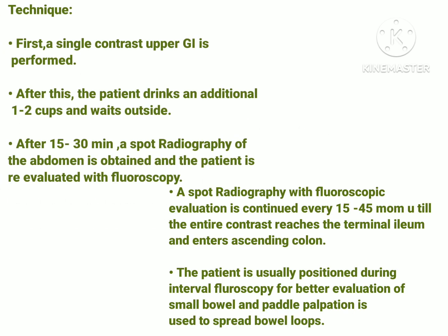Now the technique that's important, it means how the procedure is done. There are multiple different techniques that can be used to perform this barium meal follow through. We will discuss one of the conventional approaches. As we know, a patient starts fasting at midnight, so make sure that the study is scheduled for the next morning. Firstly, we give single contrast to the patient so that an upper gastrointestinal tract study is performed, where we can visualize the upper gastrointestinal tract, which includes esophagus, means food pipe, and stomach.